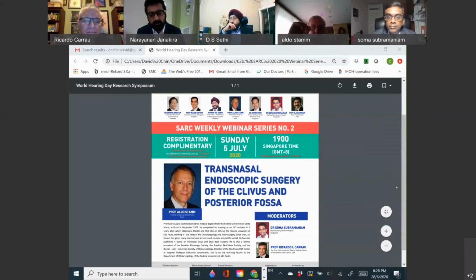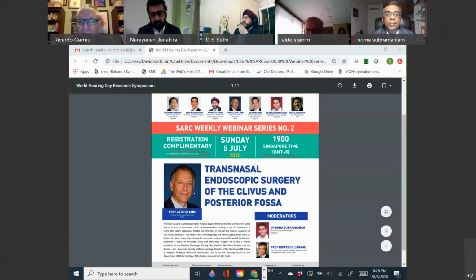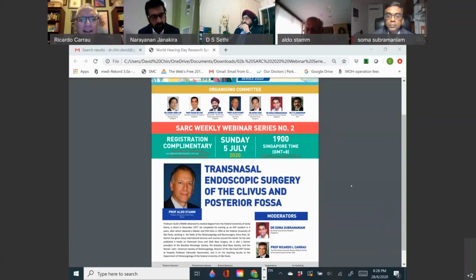Of course, the most important thing is the margins of the flap. You have a small tear in the middle. It usually has no big problem when you have these tears in the flap, so it makes no big difference for me. The thing is that if you have a big spur and you have the ability to take the flap from the other side, that's what we do.